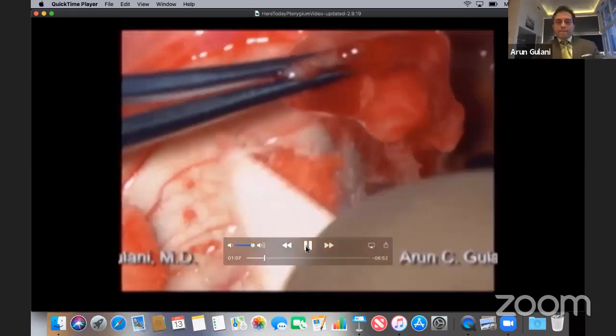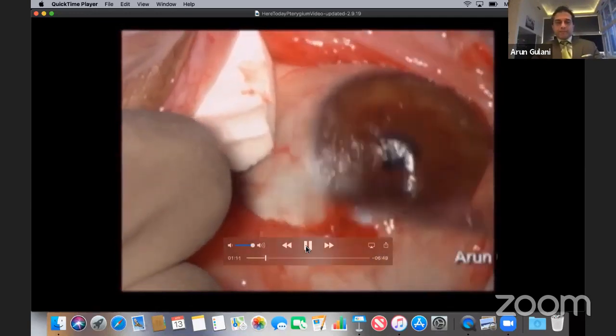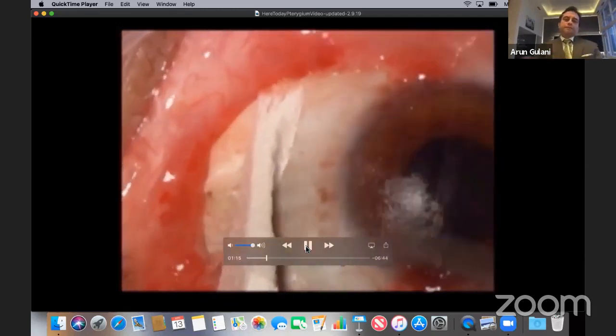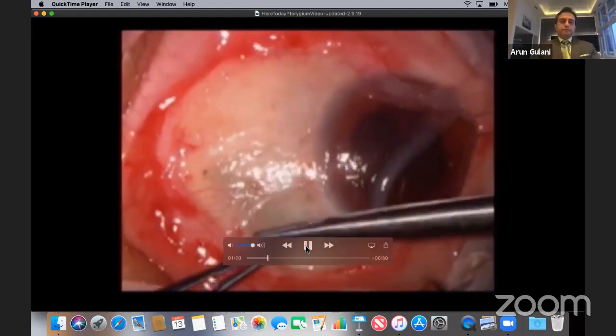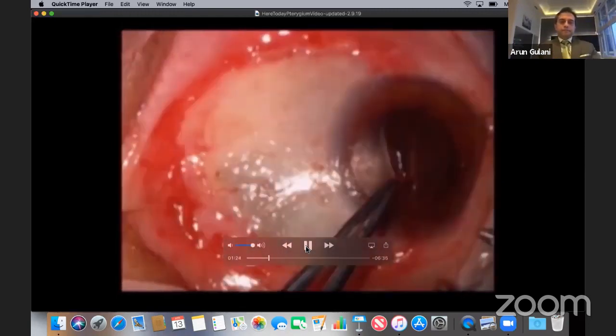Use a 64 blade to clear the cornea, limbus, and episclera, literally like an eraser in fast, smooth movements. Receive the amniotic graft. Place it onto the scleral area. Sweep it into place under the conjunctiva.